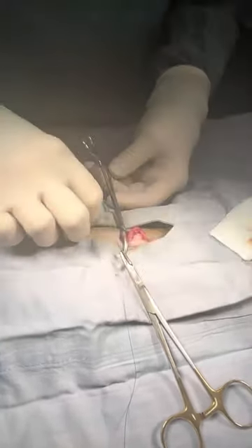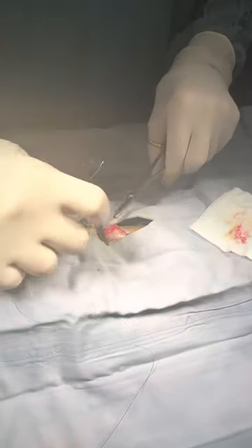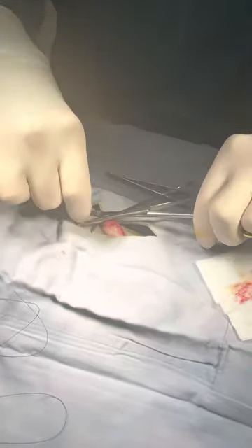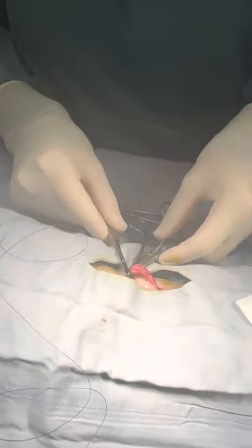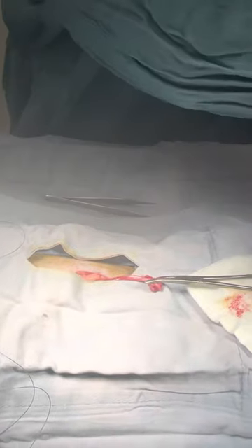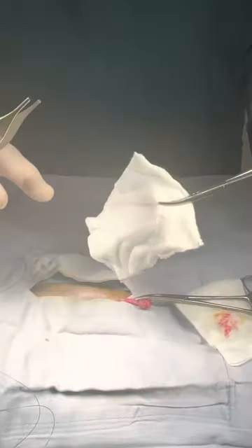What we're doing here is tightening up this ligature to make sure that there won't be any bleeding after the tissue is removed. We always do six throws on our knots to make sure that they're nice and tight and there won't be any slippage. Then we go ahead and remove the ovary from the pedicle. We replace the pedicle back in the body and then check for bleeding with our hemostat — just down in with our gauze — and there's no bleeding, so we're happy.